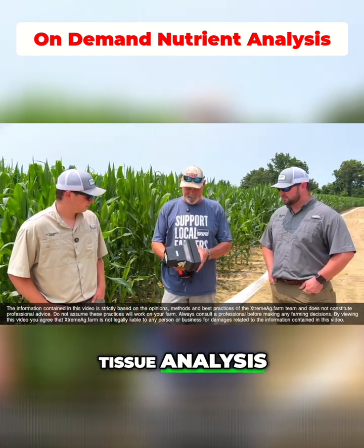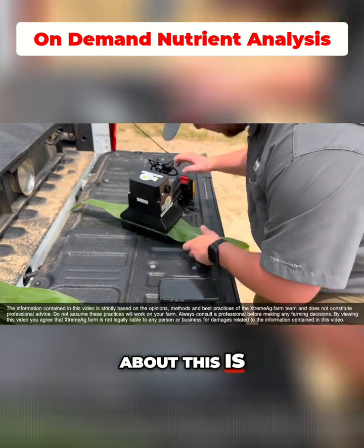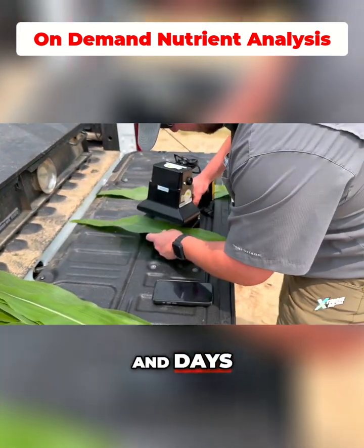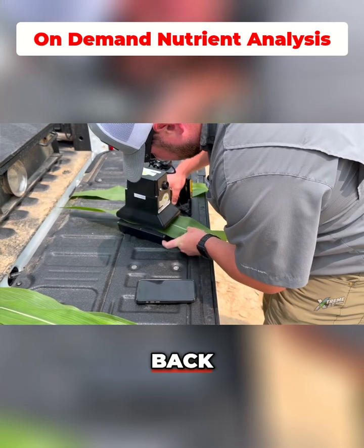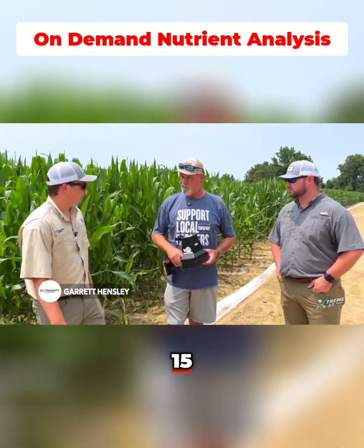This is an on-demand tissue analysis machine. What's really cool about this is instead of waiting days to get your tissue samples back, this is how long — after you pull them, you can probably get them back in about 15 to 20 minutes.